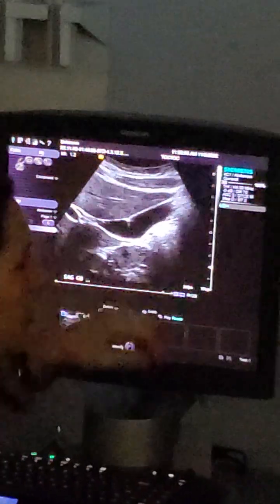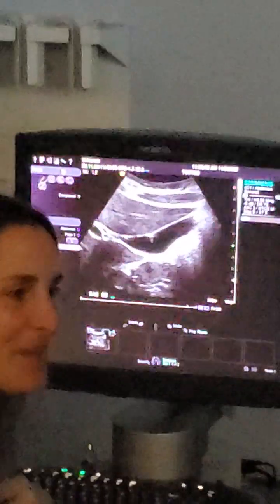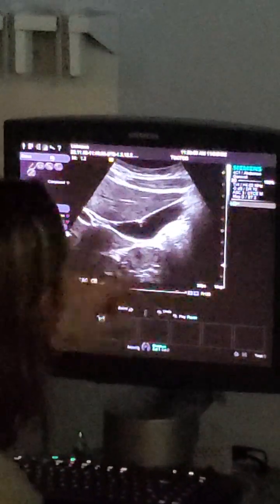See how thick this posterior wall looks? You remember learning about refraction yesterday? Weird. It's almost like physics is physics. So we always want to measure the anterior wall.